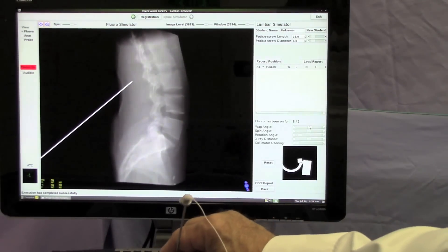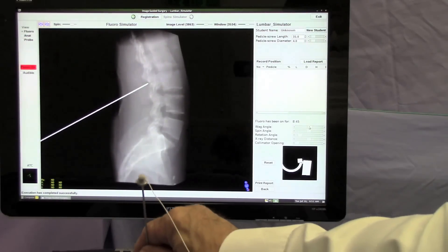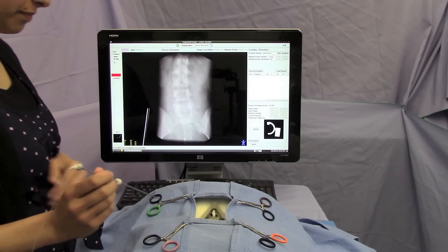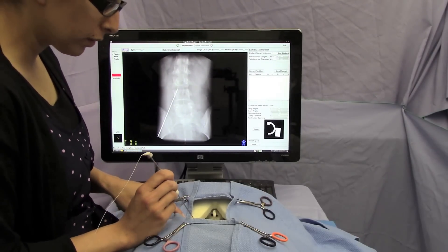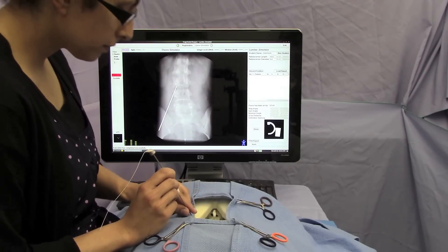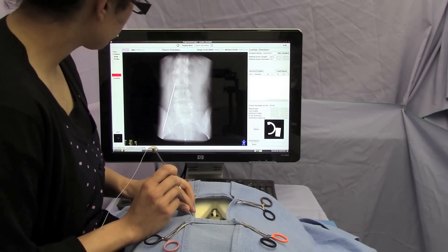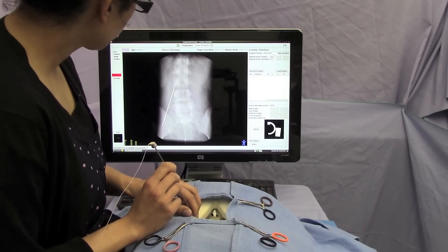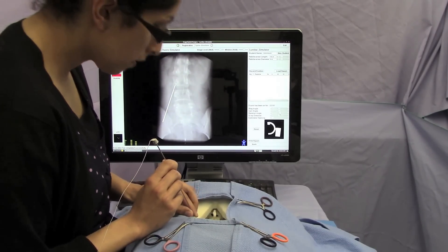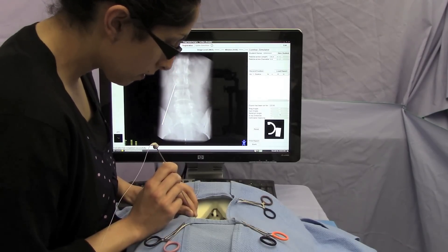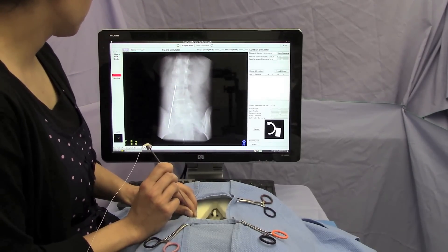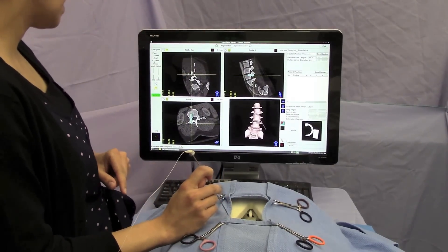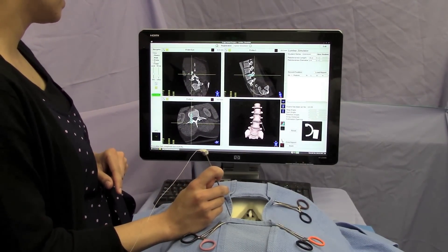Reorienting the unit during the procedure is as simple as orienting a routine fluoroscopy unit, and here a user is establishing what they consider to be the appropriate trajectory for a selected screw diameter and length. Once the trajectory is selected, the lateral view was requested and then the trajectory was established and evaluated.